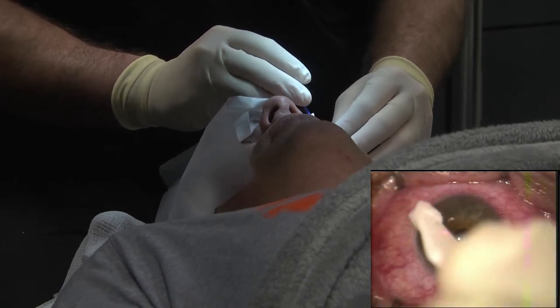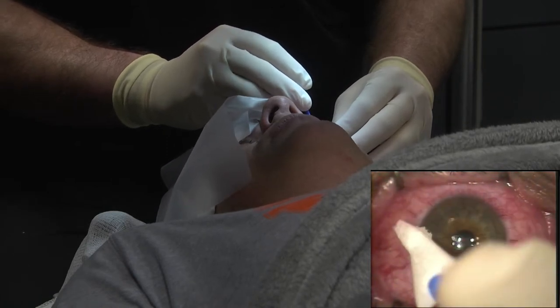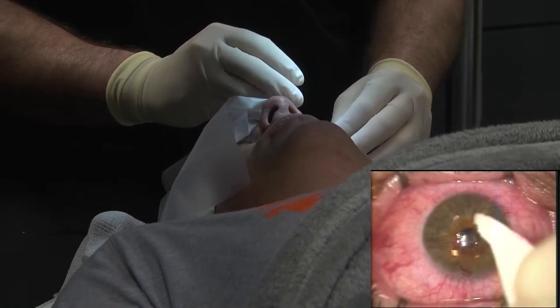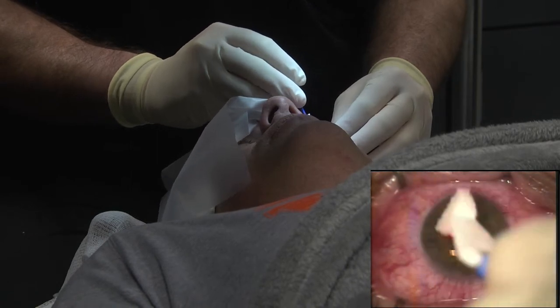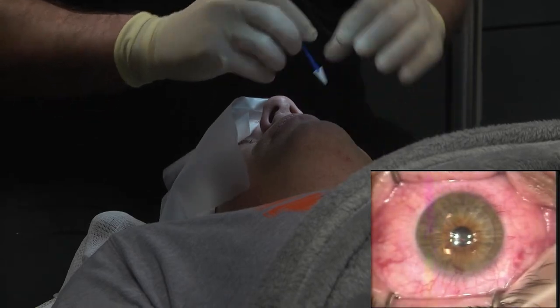Your flaps went beautiful. Your corrections went beautiful. LASIK doesn't go any better than this buddy. And tomorrow you'll be driving without glasses. Isn't that exciting? Sounds good.